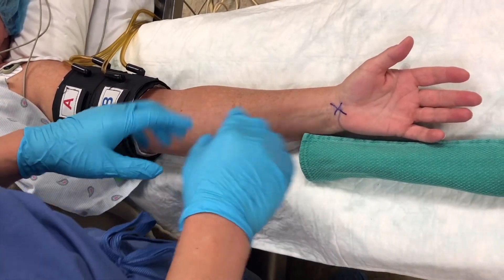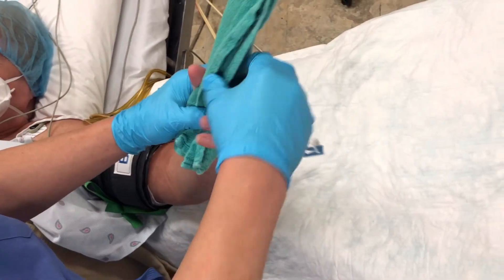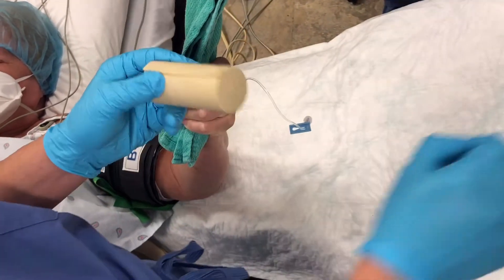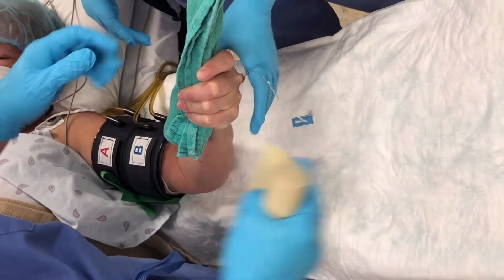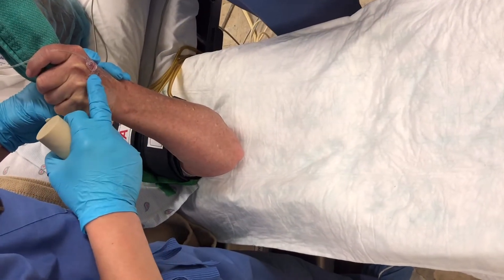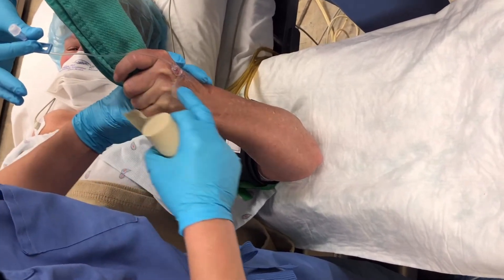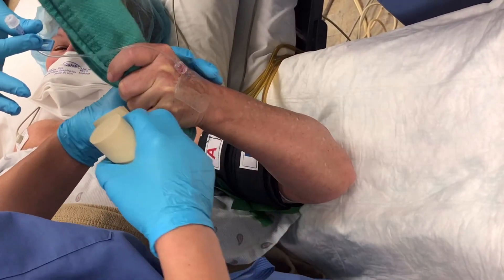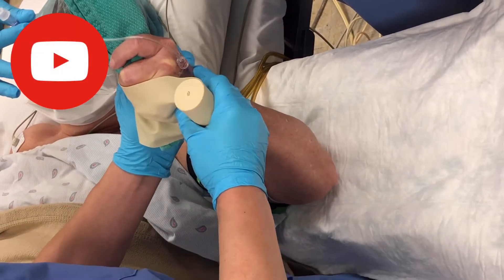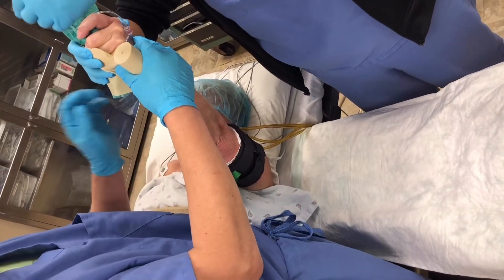Next we're going to exsanguinate the blood. Have the patient hold a green towel and squeeze the hand. Put a 22-gauge IV with a small extension tubing. This tubing is for injection of the lidocaine — half percent lidocaine. Have the patient raise the hand up to exsanguinate the blood.